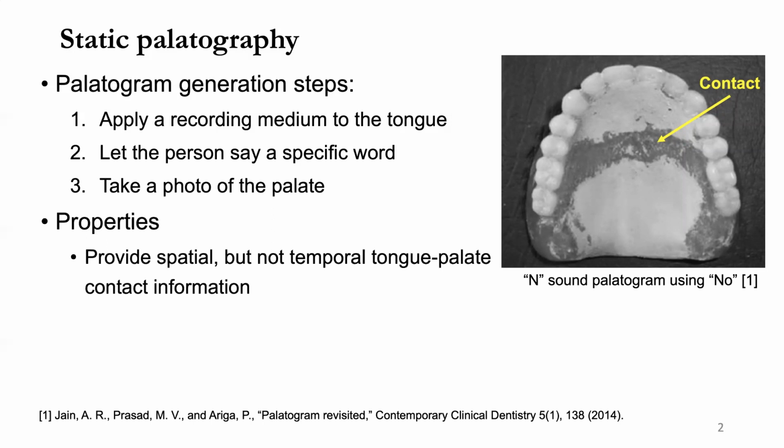The obtained palatograms provide spatial tongue-palate contact information. However, it doesn't assess the tongue's contact with the palate over time, for example, during a speech phrase or swallowing. Besides, the recording medium usually tastes unpleasant.